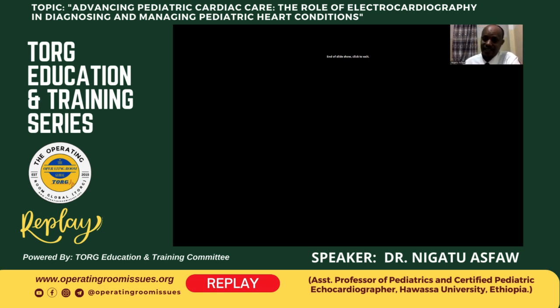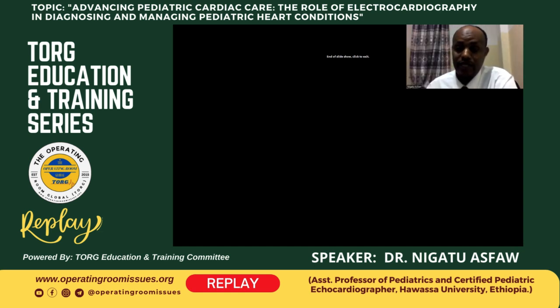And if there is no normal physiologic right axis deviation in young infants or neonates, that means there is no physiologic dominance of the right side, so there may be right-side heart problems like tricuspid atresia. Other important clues can also be found from the ECG, but we cannot conclusively reach an exact diagnosis.